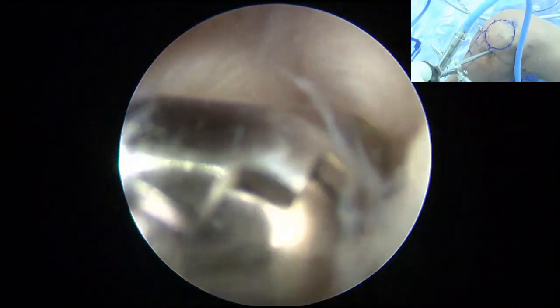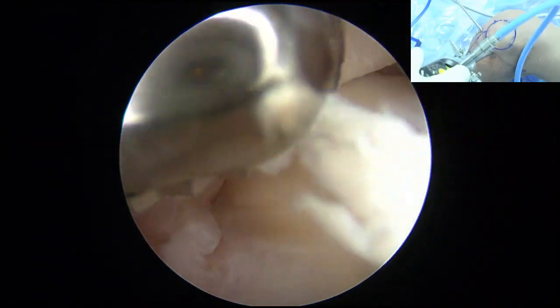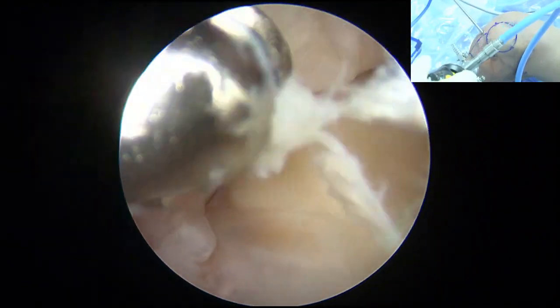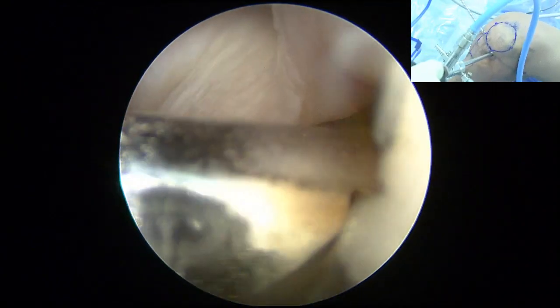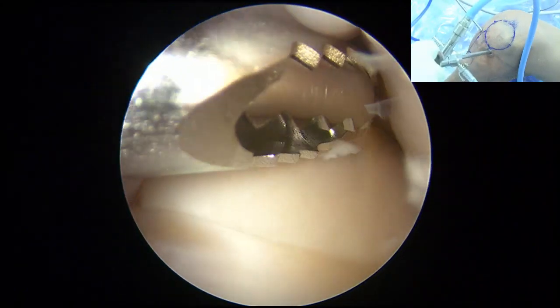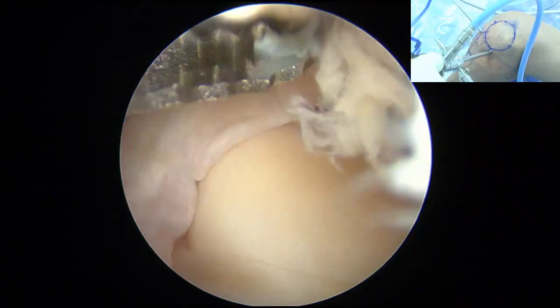You have to see the anterior horn of the meniscus. Very nice. Take a look at the anterior horn. That is the anterior horn of the meniscus. It's a very important landmark, and you need to find it. Today the anterior horn is in very good condition. Many times there is some soft tissue impinged into the joint here that causes a lot of pain, so you need to remove that fat tissue that impinged into the joint.